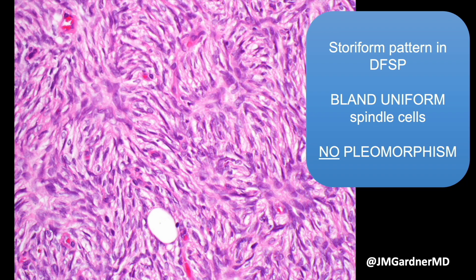Here is the classic storiform pattern — a tighter storiform pattern than what you see in dermatofibroma. The cells are bland, uniform, thin, stretched-out spindle cells with no pleomorphism, with the rarest of exceptions. I think I have seen precisely one DFSP with pleomorphism, and it had been previously radiated — it was a recurrence post-radiation, and the radiation may have contributed to the pleomorphism in that case.